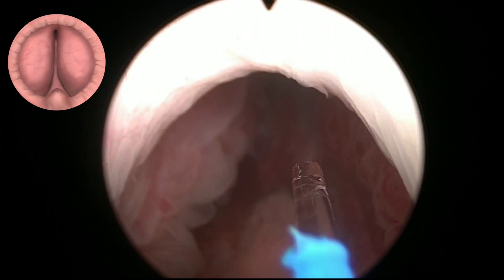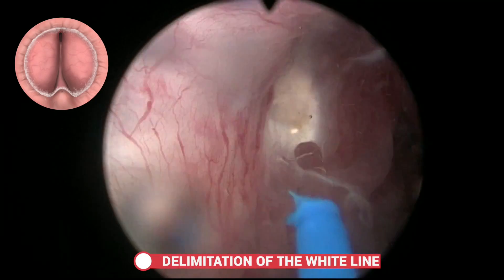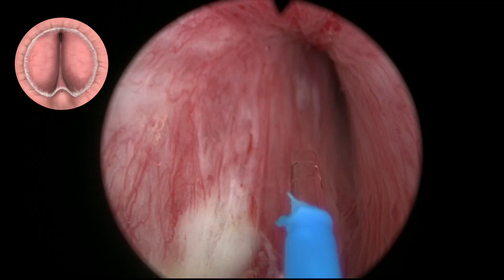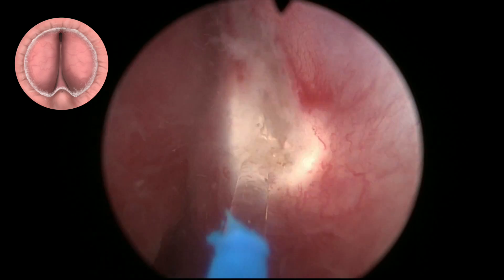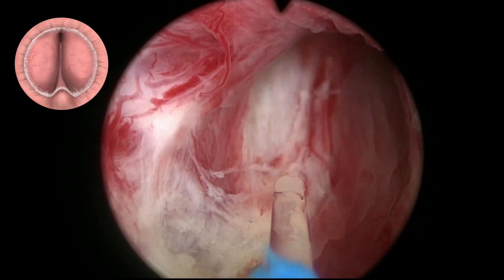The initial step is to mark the white line, which is a way to set the landmark of the sphincter. The fact that we cut the mucosa at the beginning of the procedure ensures that it's not going to break, as it did with the three-lobe classic technique.